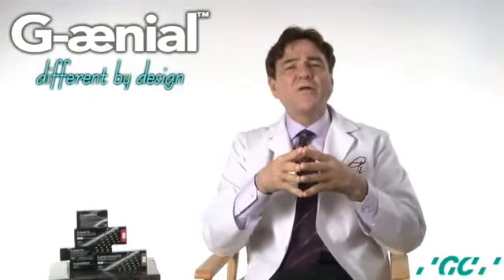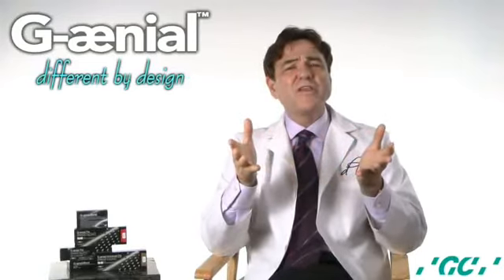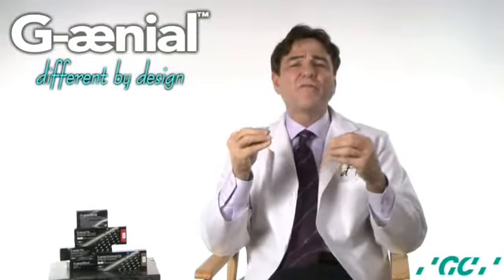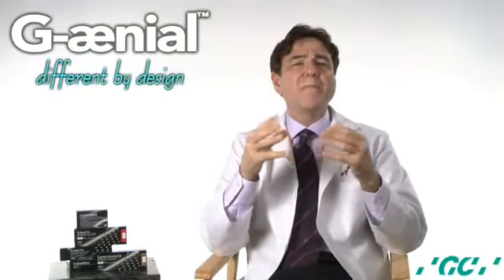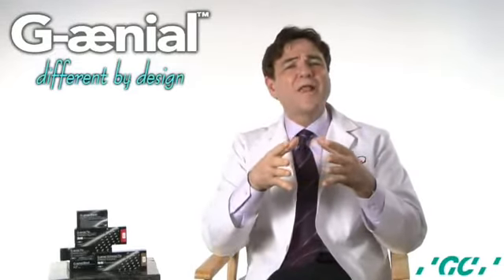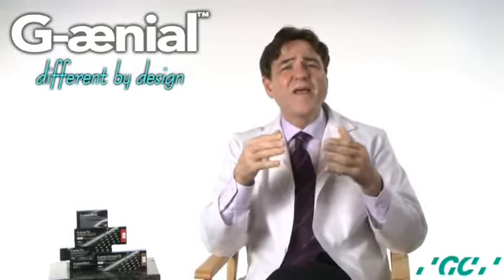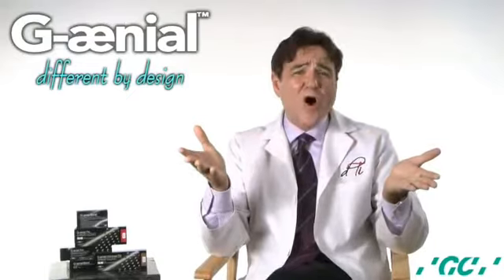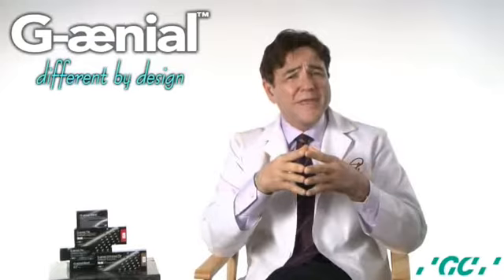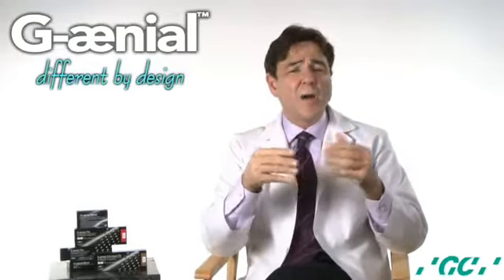Although the nanoscale is small in size, its potential is vast. Applications of nanotechnology in dentistry have only approached the horizon, with opportunities and possibilities for the future that can only be limited by our imagination. These next-generation flowable composites are not designed to replace other therapeutic modalities, but to supplement the services that are offered to our dental patients. Although the long-term benefits of this nanocomposite G-aenial universal flow remain to be determined through clinical studies, the mechanical and physical properties suggest a promising future.